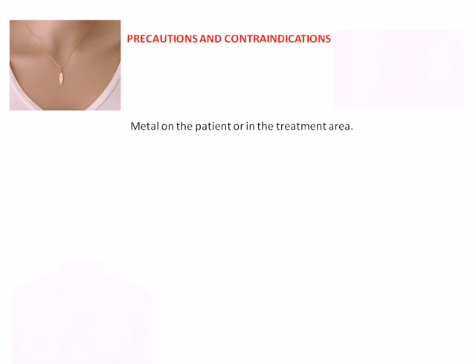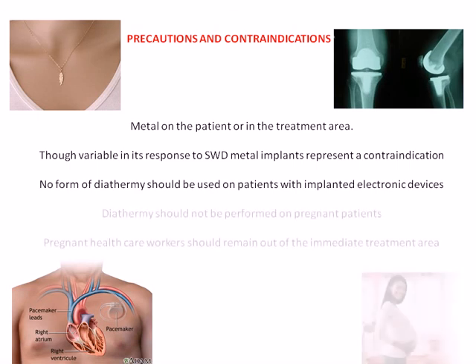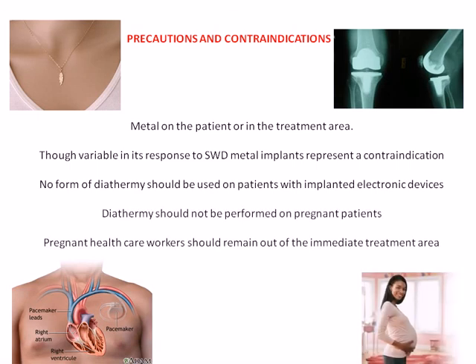The presence of metal implants and implanted electronic devices are also contraindications. Diathermy should not be used on pregnant patients, and pregnant healthcare workers should remain out of the immediate treatment area.